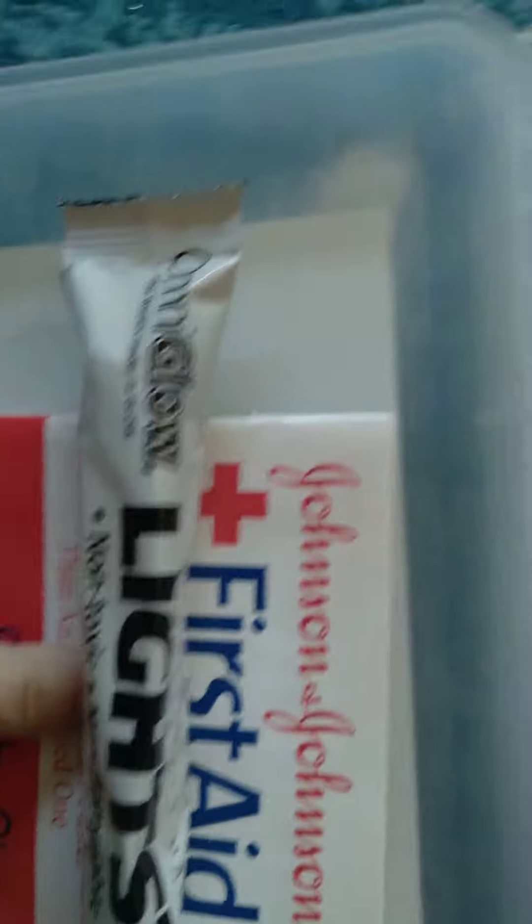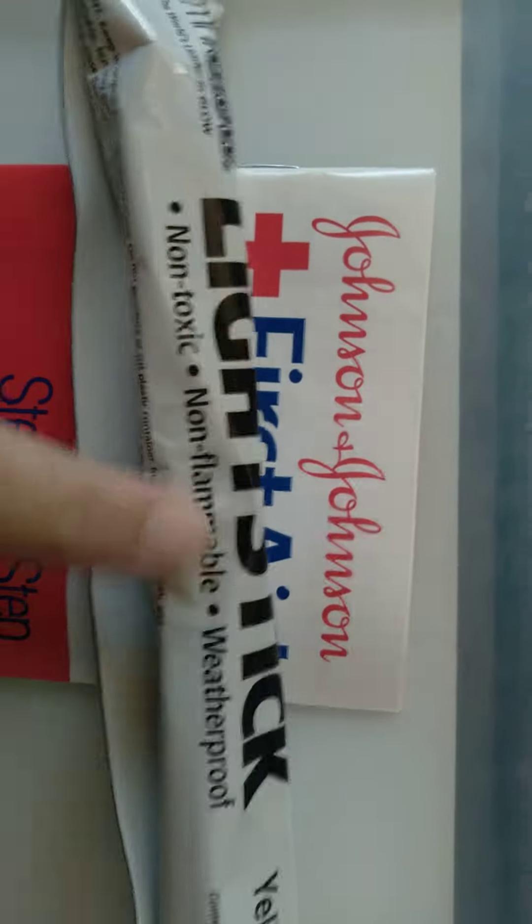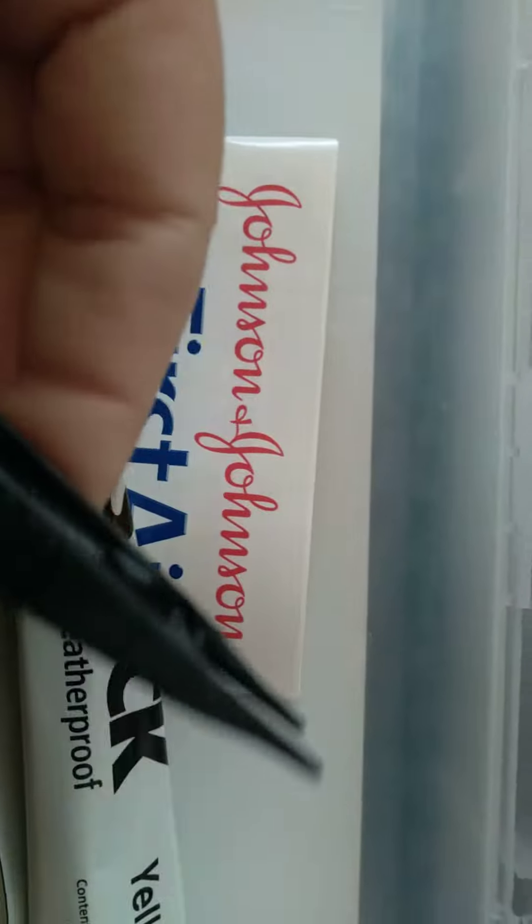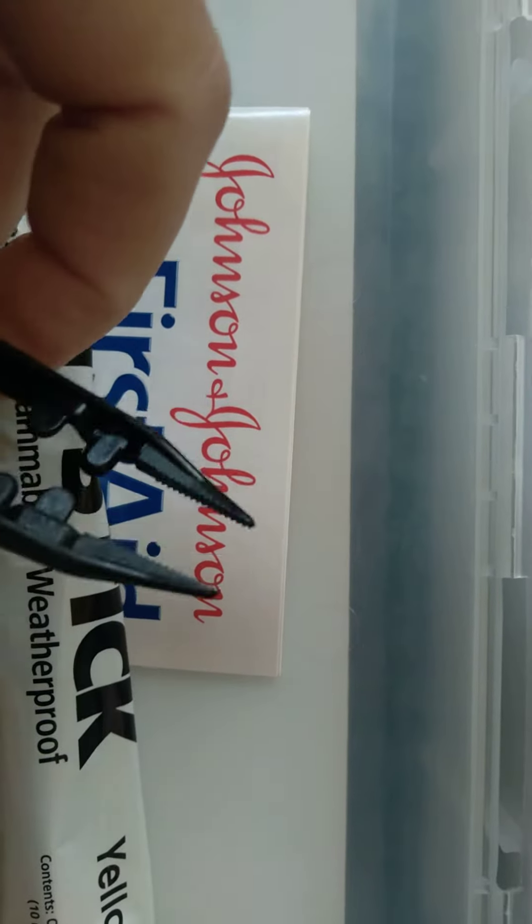There are some gloves, some bandages, a step-by-step guide, and a light stick — kind of like the ones you use for trick-or-treating at Halloween. There are also tweezers — super, super fine tweezers — like you really need those.